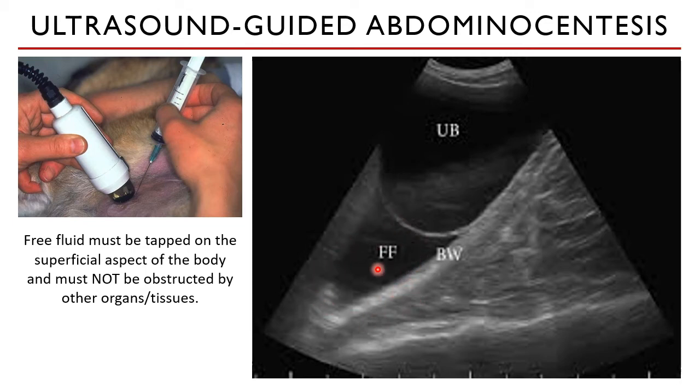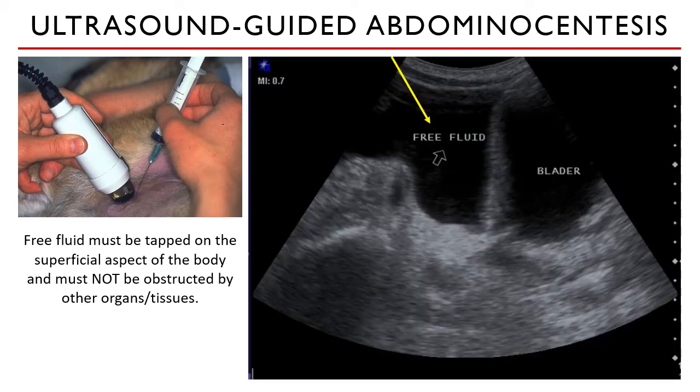So how do we move this free fluid up to the most superficial area just beneath the skin? Our technique there is actually to gently shake the body of the patient to displace any tissue on top of the fluid and bring the fluid up. Again, another factor for that is you need to have a significant amount of fluid for that to be moved superficially.